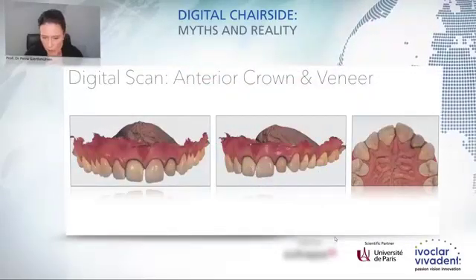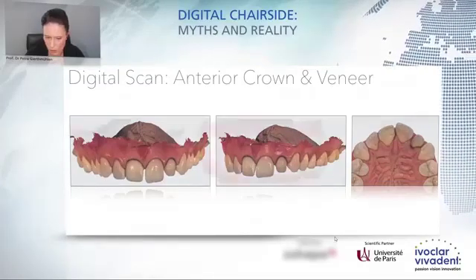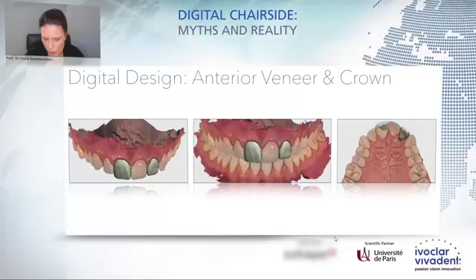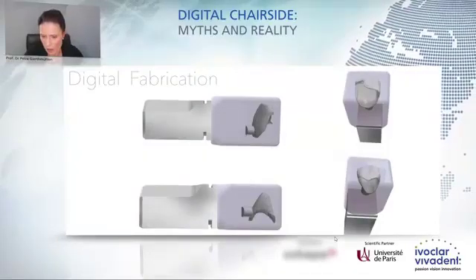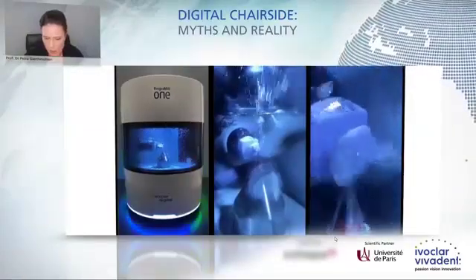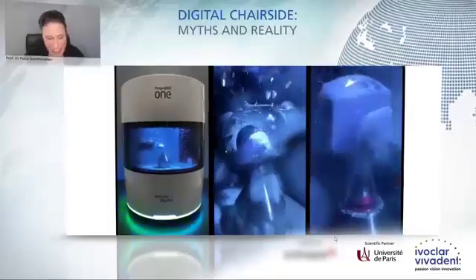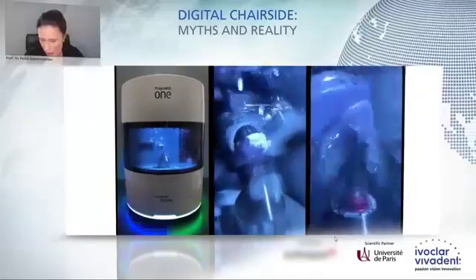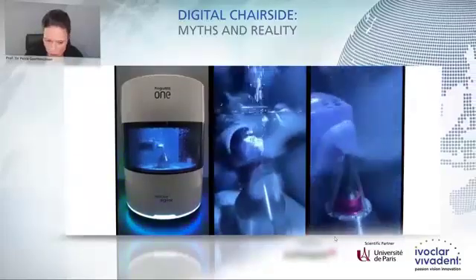And here you can see the final digital capture of the preparation of those two central teeth. And here is the final digital design of those two restorations. And here are those restorations placed within the all-ceramic block. And then this file is sent to the milling device, and this shows the first and smallest 5-axis milling machine, and you can see nicely how thin the margins are and how precise the milling is performed by this machine.